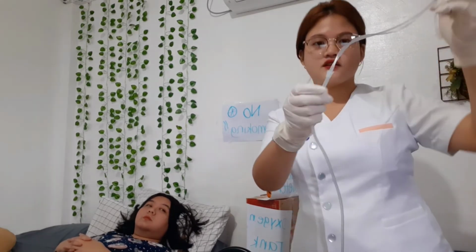Then next, you're going to apply the appropriate oxygen delivery device to the patient. So the rationale for that is to start the administration of the oxygen therapy. So of course, for the nasal cannula, you need to place the nasal prong in the patient's nostril, which is this one. Then you need to secure the cannula in place by adjusting the tubing around the client's ears and using the slip ring, which is this one, in order to stabilize it under the client's chin. So if the cannula will not stay in place, tape the side of the face.